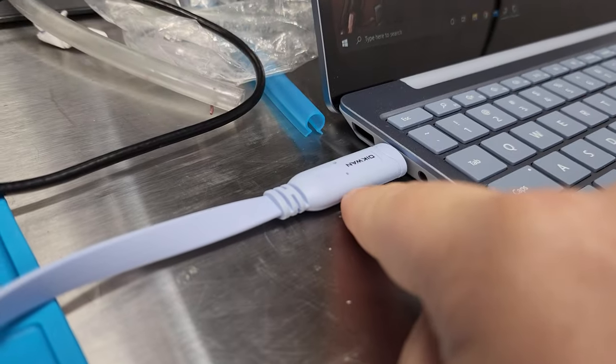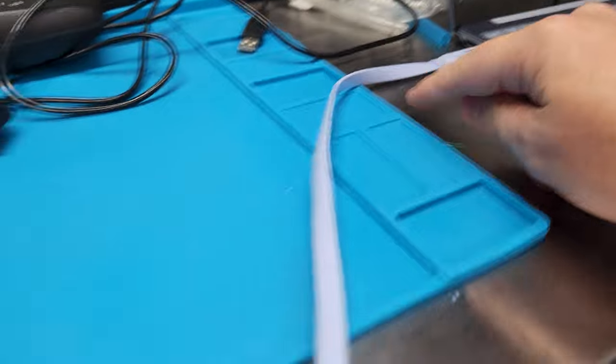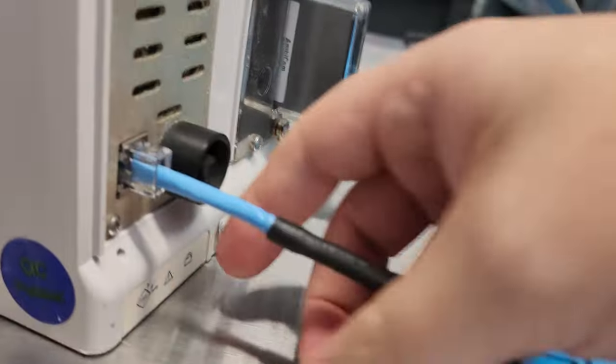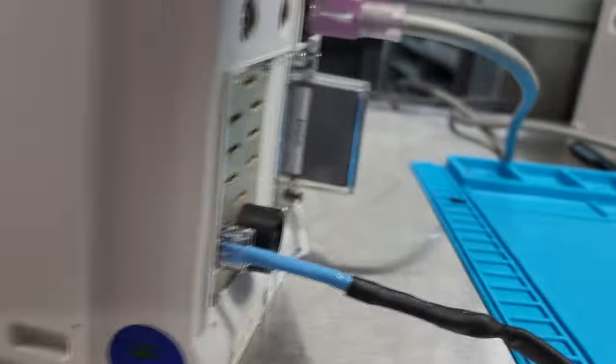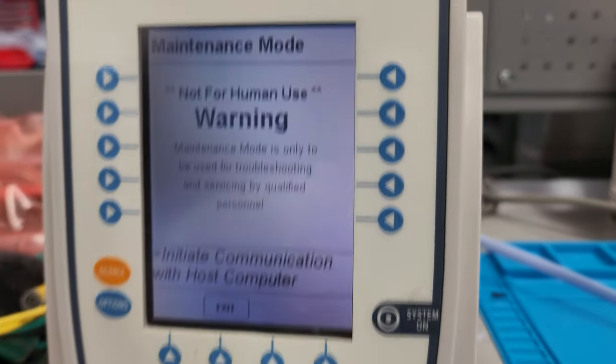Here you can see this actually has the chip in it — the communications, the serial port server. It's a flexible cord so it's going to stow easily, but this is just a prototype. We cut the end off our RJ45, found the correct pinout between the two devices, and it's working.